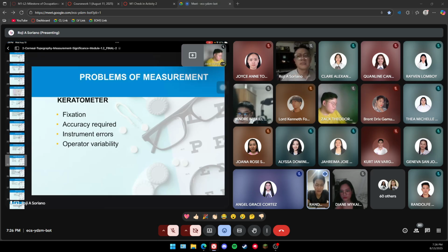Doc, others have error of reflection. I don't have, so there's a difference. They might need to adjust the instrument.